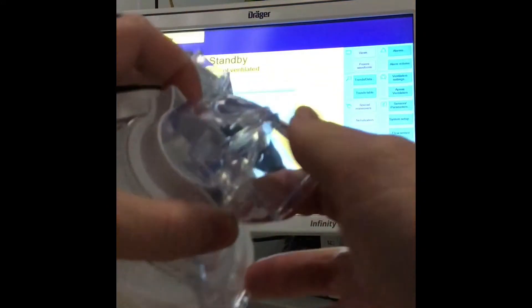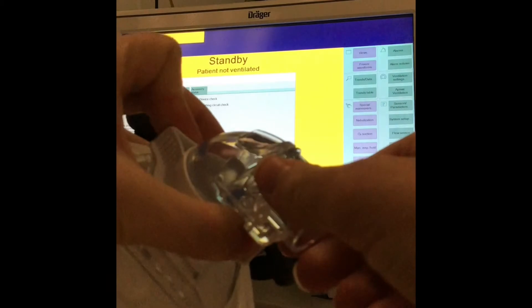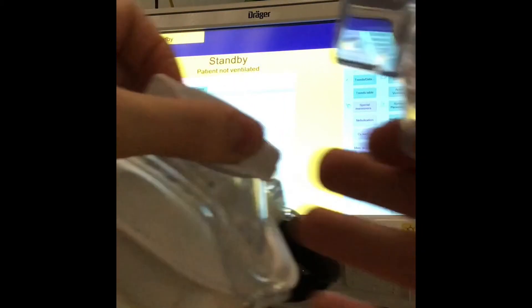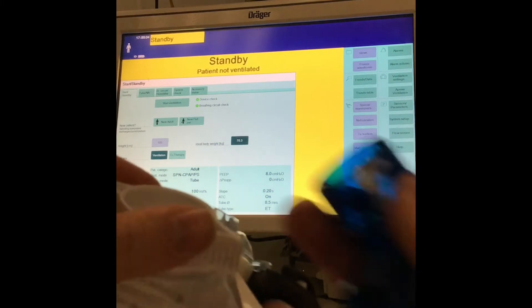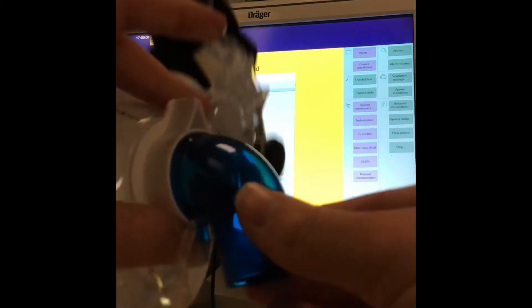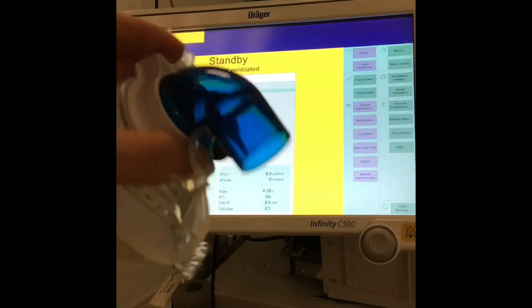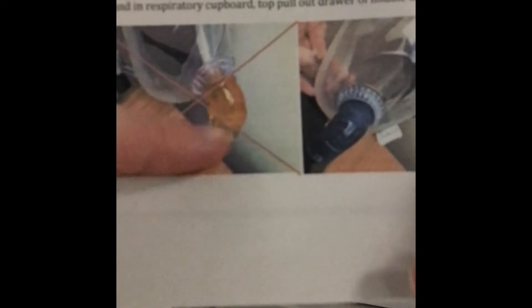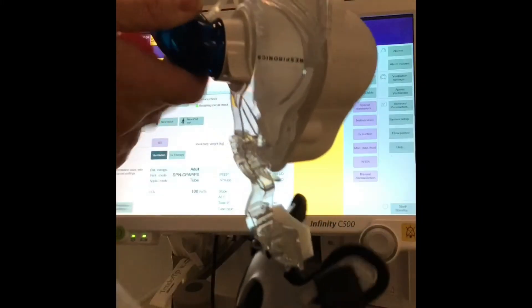So this bit will come off — twist by pushing these two levers here, and it needs to be replaced with this blue one to make it compatible with the ventilator tubing. On the full face mask, you'll need to remove this orange one and connect the blue there. The blue connector will then connect straight onto your ventilator tubing.